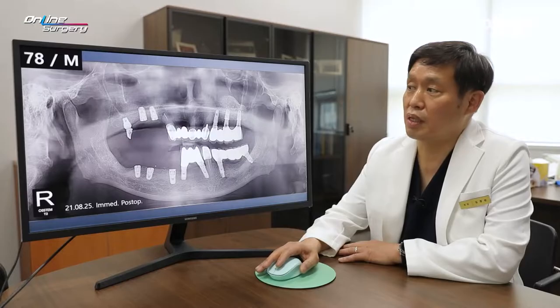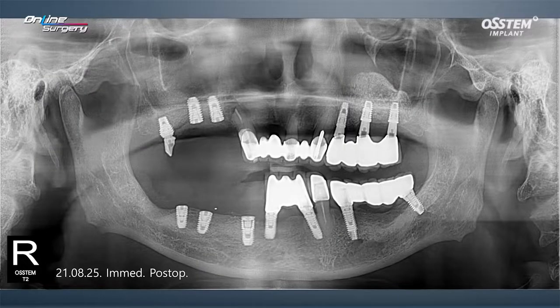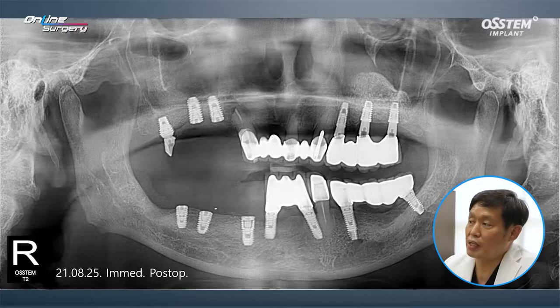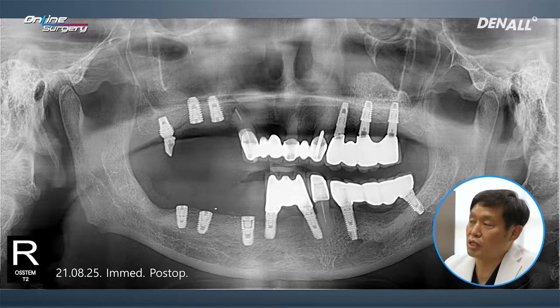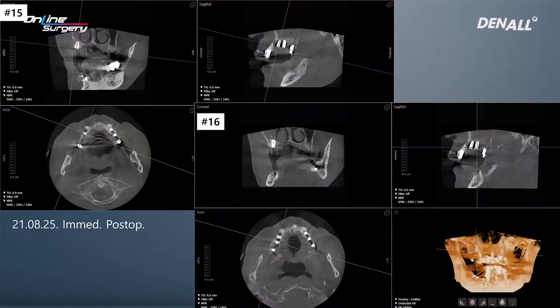This is the immediate post-op image. During surgery, the distal implant prosthesis failed and the crown was removed. The distal side of the canine root was removed. Because the space was quite tight, considering the prosthesis on the most distal side, two implants were placed in number 15 and 16. Bone graft was done.